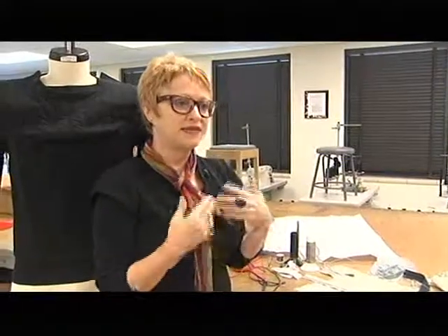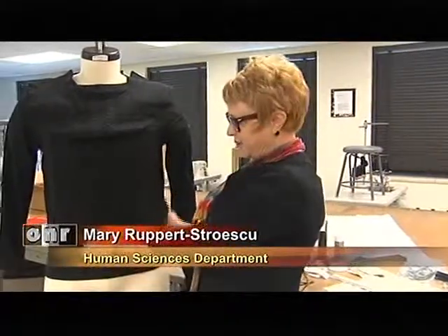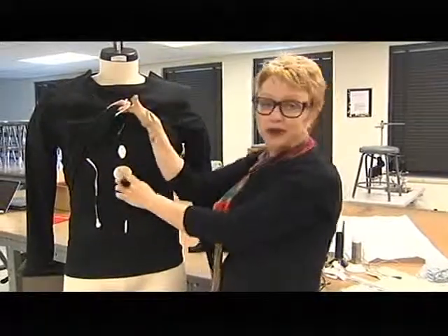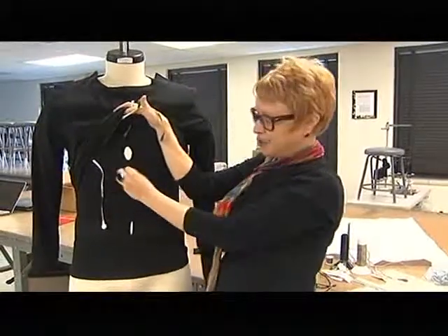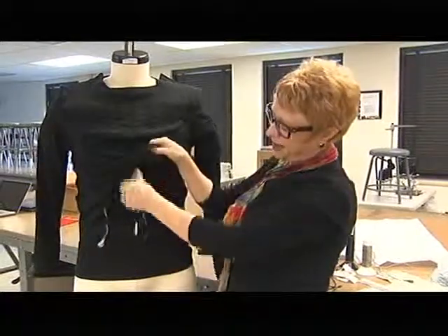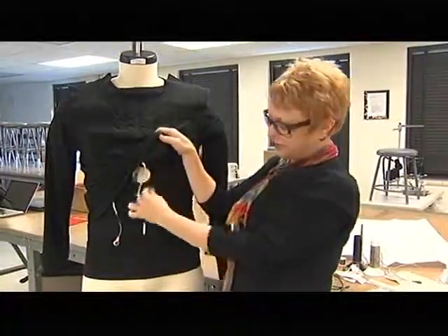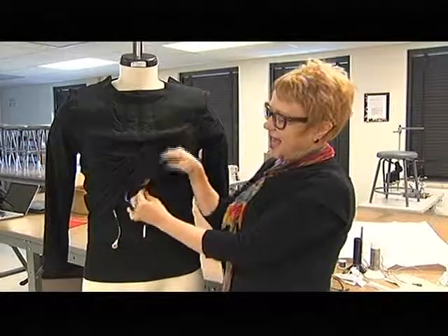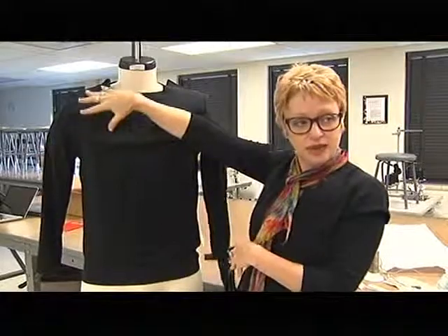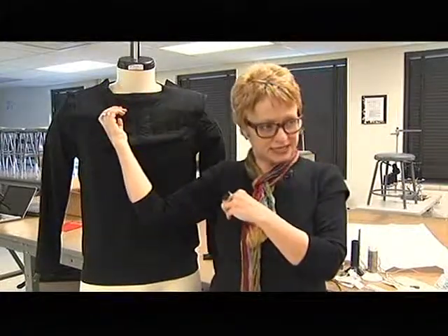So we devised a system that is in two pieces. We have an undergarment that helps the user know exactly where to place the electrode, so it has these openings, and then an overgarment that has these snap caps that would snap onto the electrode and continue up into a piece up here that holds the central processing units inside.